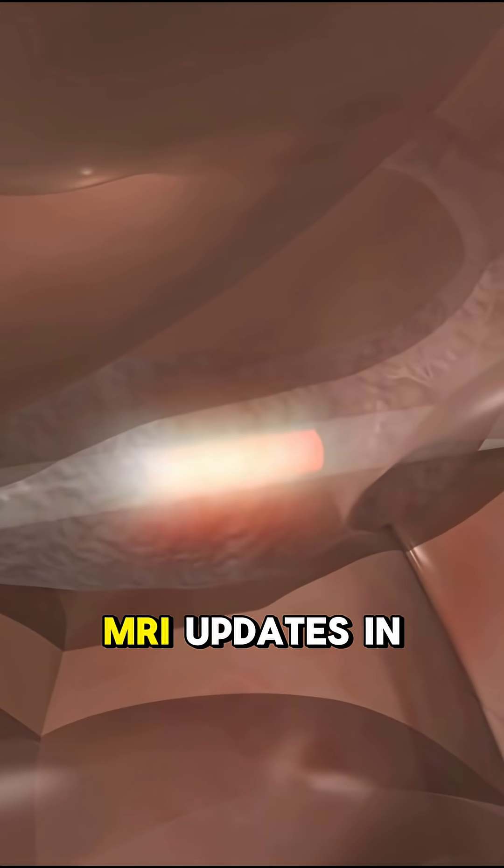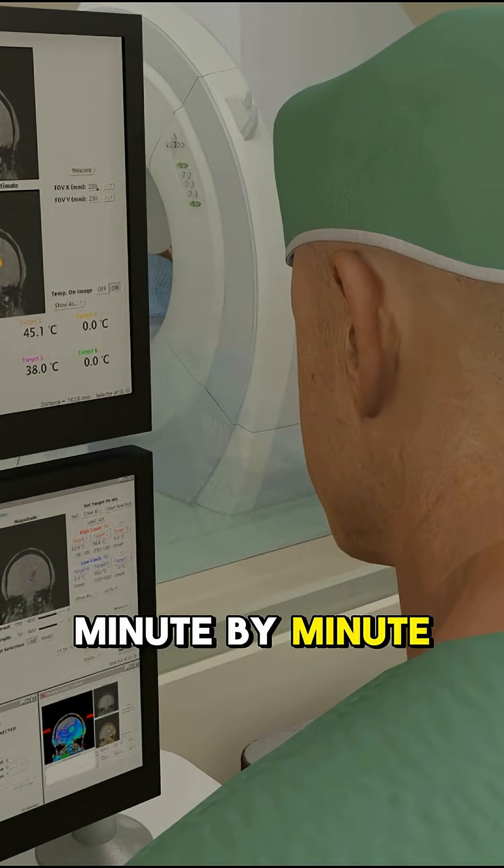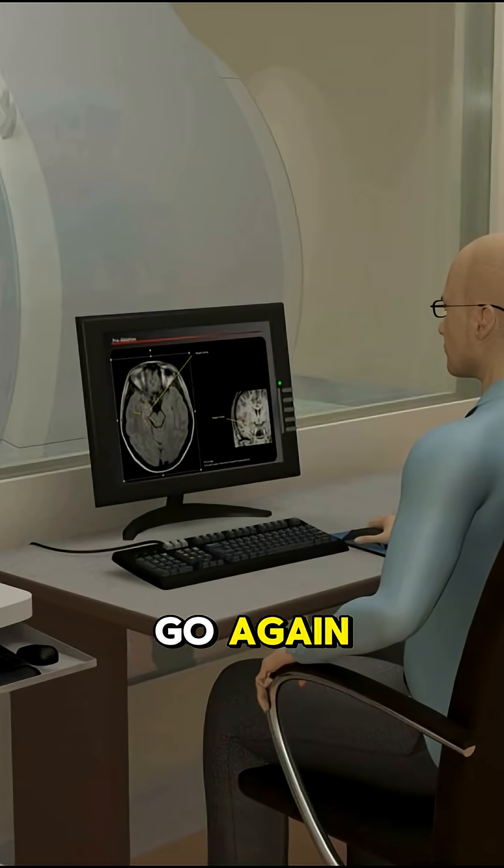All while the MRI updates in real time, showing thermal maps and tissue damage minute by minute. If it doesn't hit the whole target, they reposition and go again.